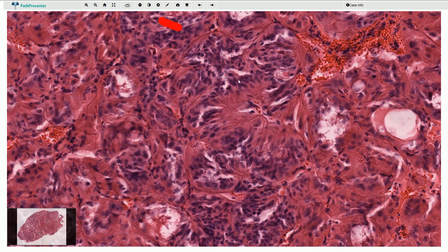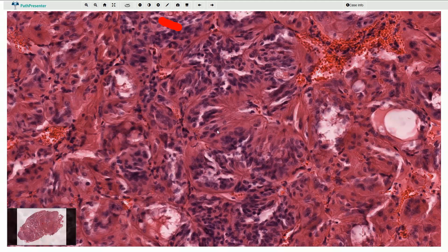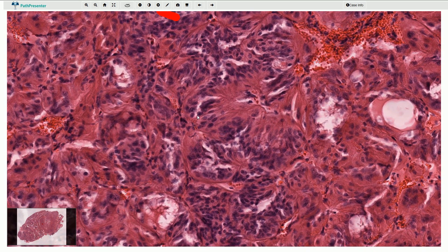The nests are composed of slightly elongated uniform cells arranged in a specific pattern. We can see the typical arrangement where all the cells have similar orientation. This is also sometimes called trabecular pattern, trabecular architecture, stratified pattern, or radiating type of growth.